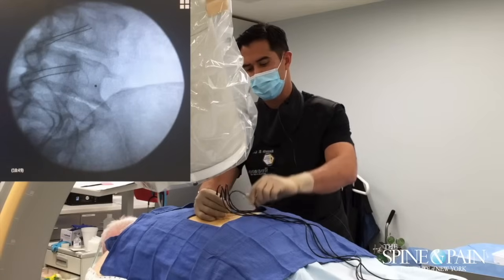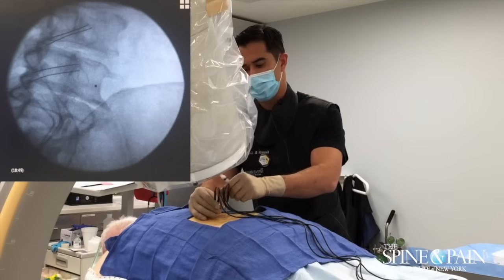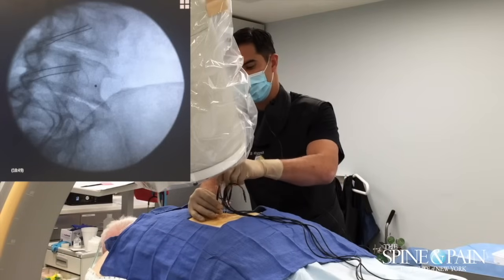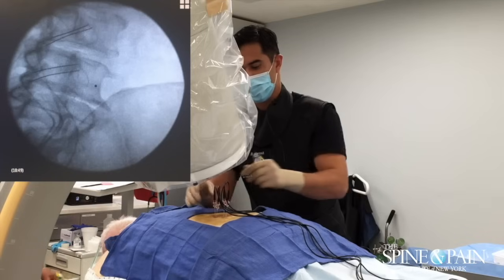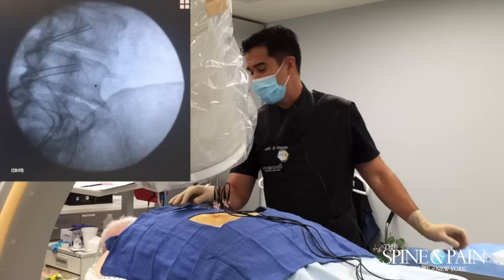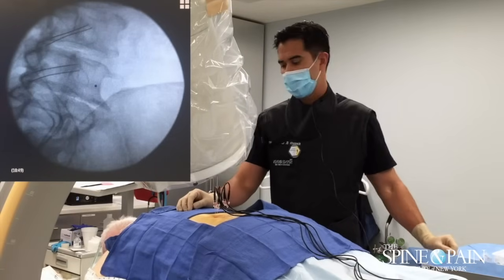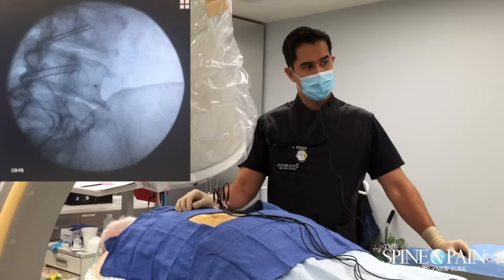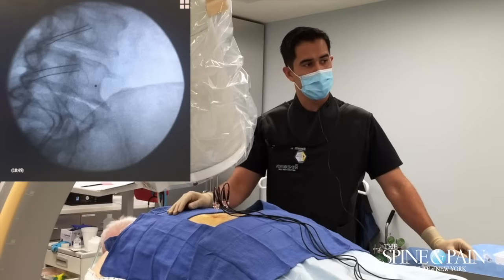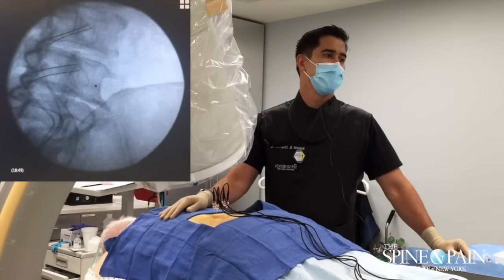Get ready to test again. Let me know if you feel any sensation in the leg — if you feel your leg throbbing or anything. Good. We're looking for whether we could elicit leg movement depending on what nerve we were on. He's just getting some local sensations — nothing in the leg, right? Good. Now we'll create the lesion.